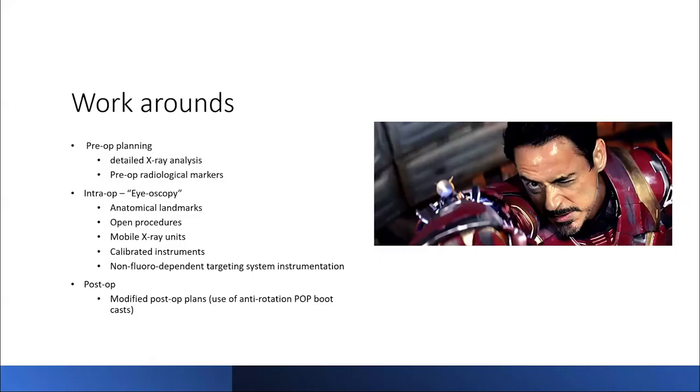And then there are non-fluoro dependent targeting instrument systems. The SIGN nail is one. We have used this. It's a bit like the workhorse for fracture and deformity correction surgery in this setting. And then post-operatively, modifying your post-operative plans, and this will be based on the type of surgery that you have done, essentially. And I'm just going to conclude with a few sample cases.